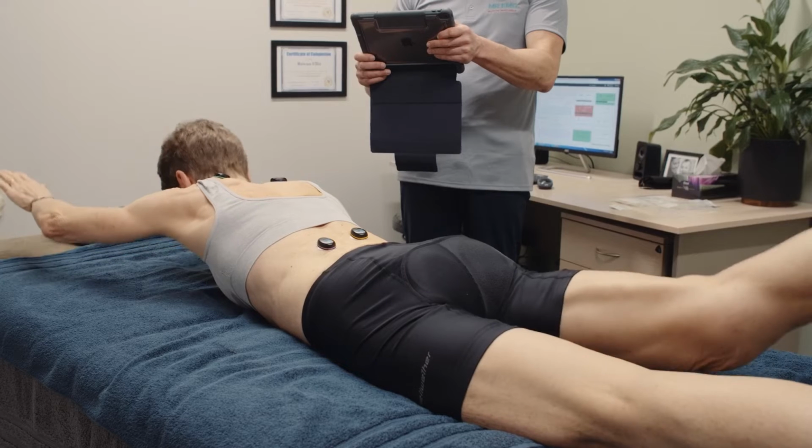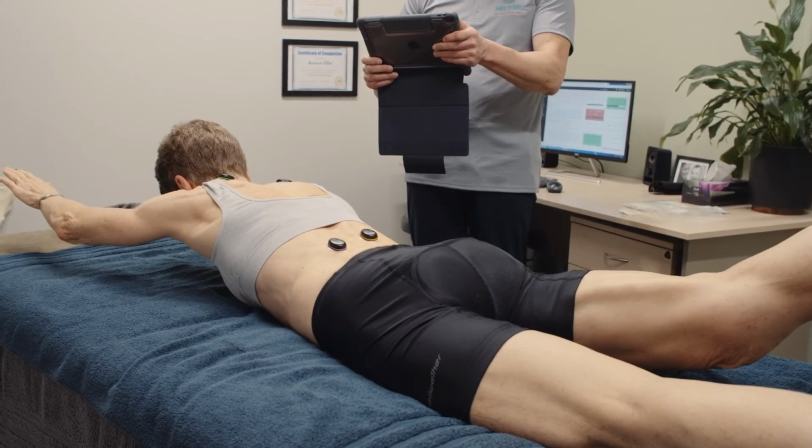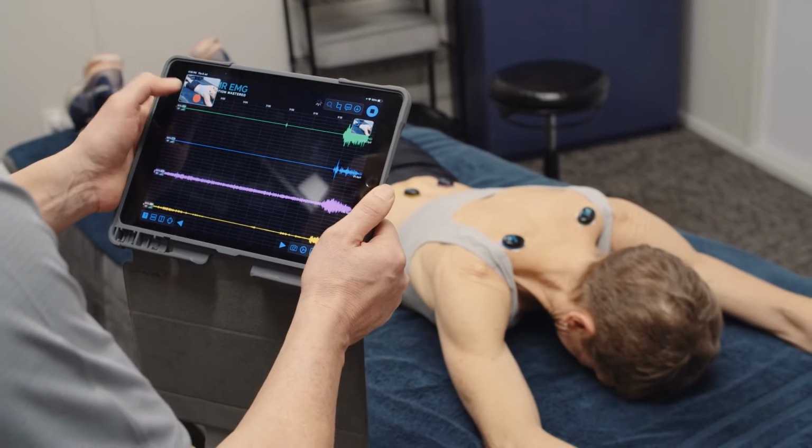If your subject is suffering lumbar pain, please modify this testing protocol to suit the individual. You do not want the movement to cause additional pain.